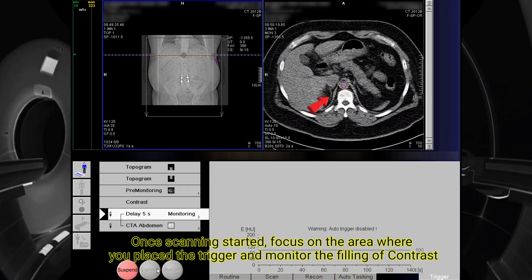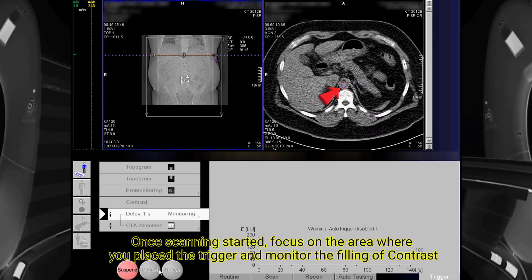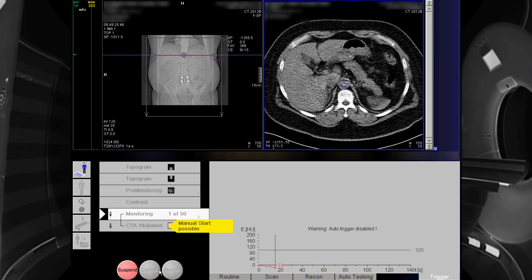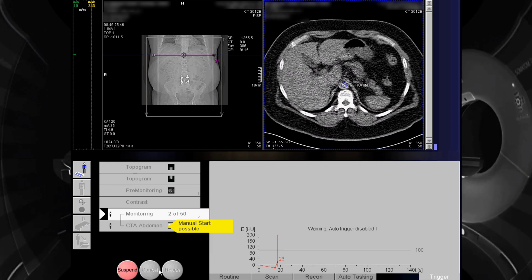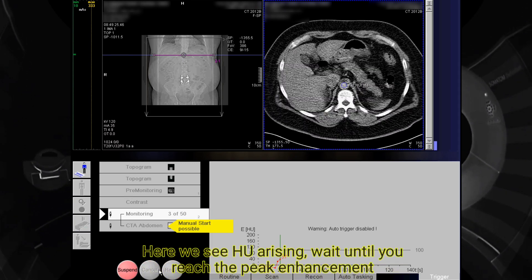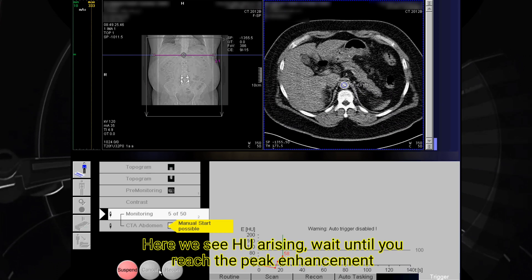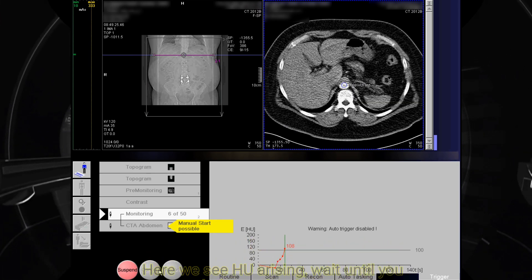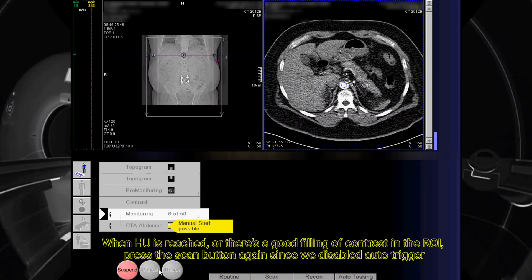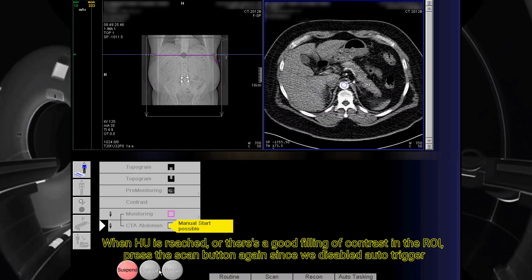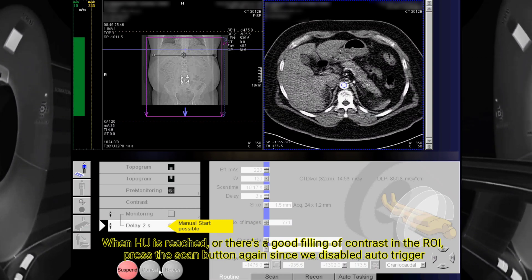Once scanning has started, focus on the area where you placed the trigger and monitor the filling of contrast. Here we see the Hounsfield unit arising. Wait until you reach the peak enhancement. When the Hounsfield unit is reached, or there is good filling of contrast in the ROI, press the scan button again since we disabled auto trigger.